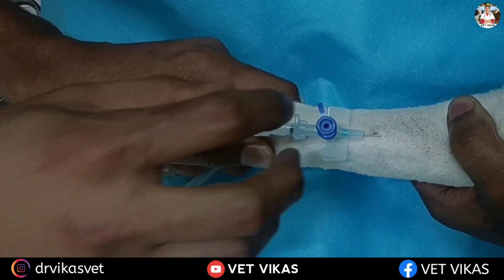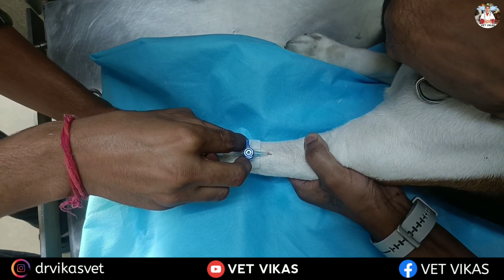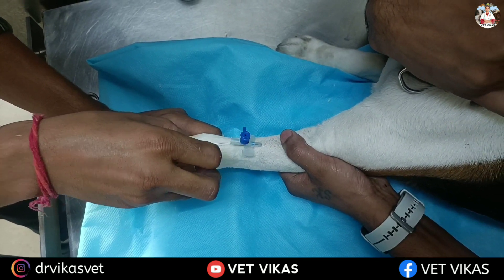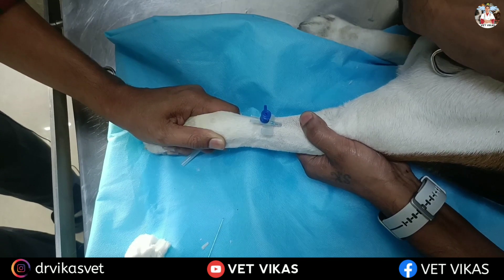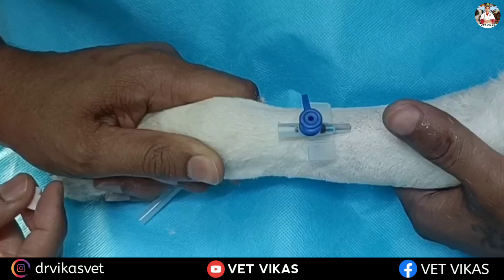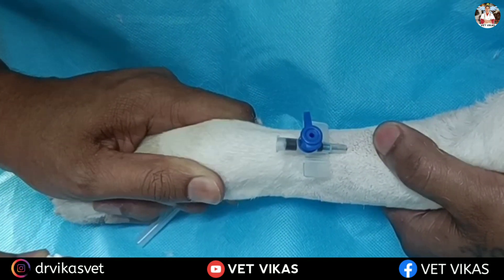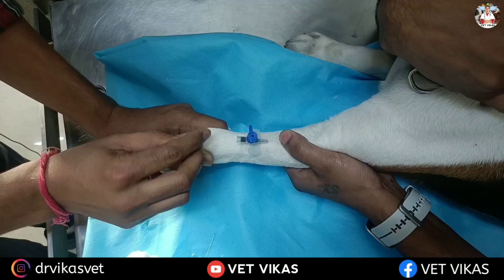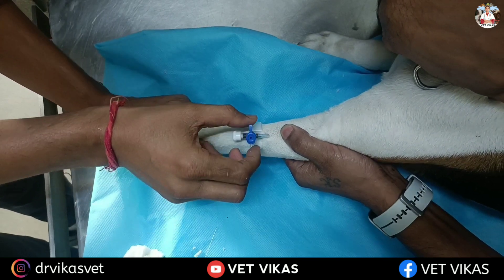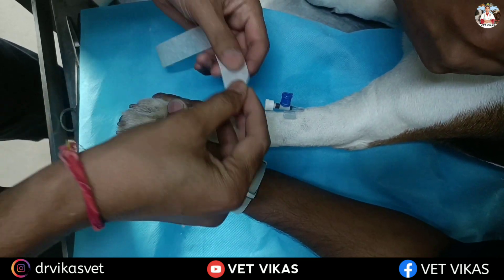Slowly you have to take off the stylet and push the cannula inside. You can see blood is coming out — that means your cannula is in the vein. Now you have to cap it.